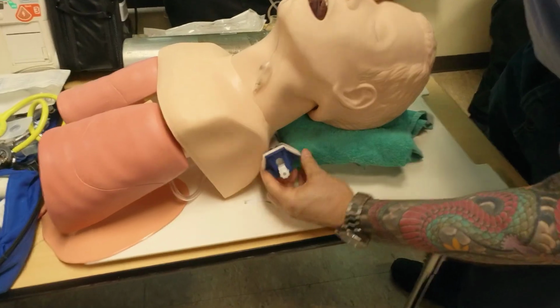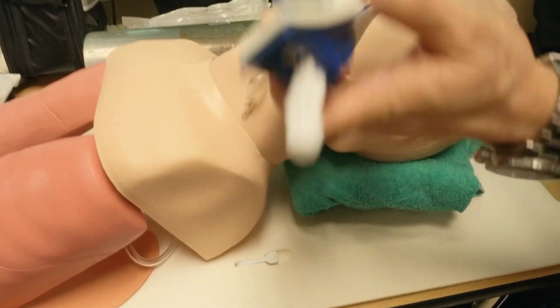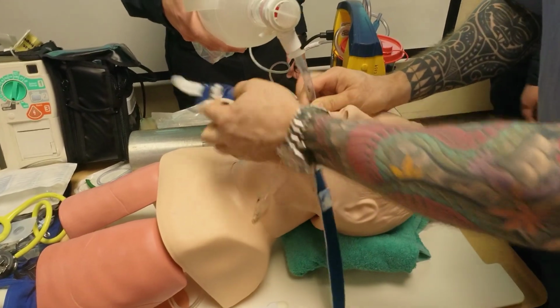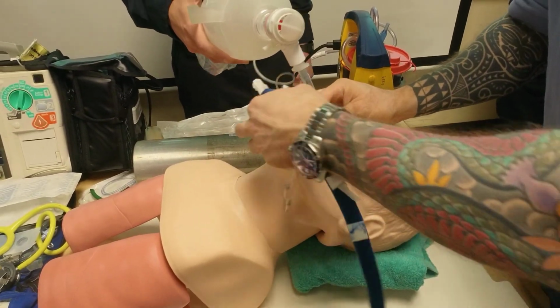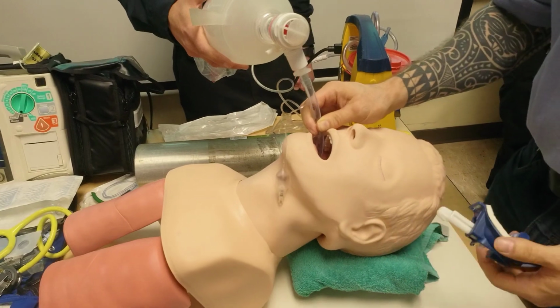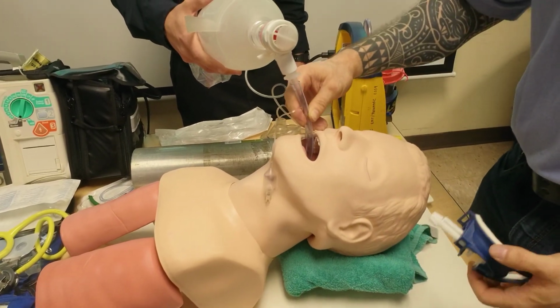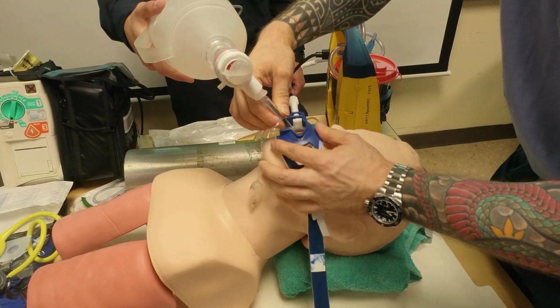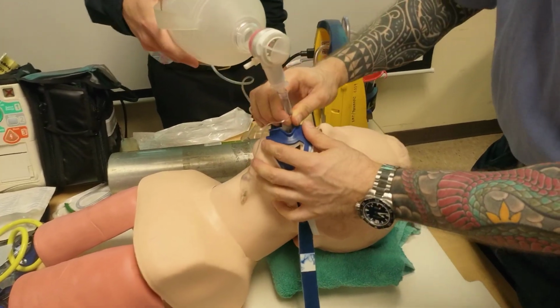So what you wanna do is thread it behind his neck. And then the next thing I want to do is, you see, this is called the bite block. And you noticed, right? What is happening to my hand about this tube? The hand doesn't leave. The hand doesn't move. It's a critical failure if you do. So what I do is I move it so that the bite block is going to sit in the mouth, right? I still don't secure it.